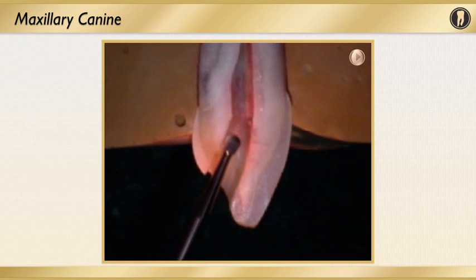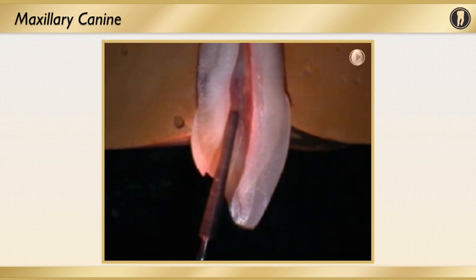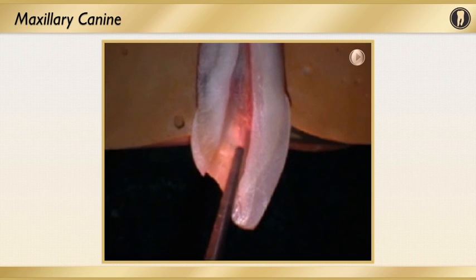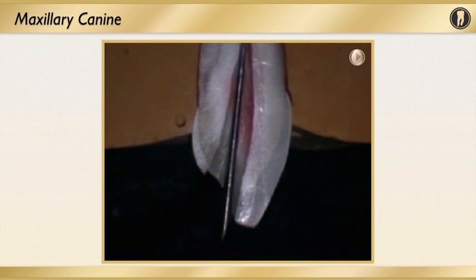And again, I like to take a long, thin diamond to refine that lingual triangle, that cervical dentinal lingual triangle, because a lot of times you don't have straight line access, and if you just remove a little bit of that lingual triangle right there, you'll be able to see the entire canal.